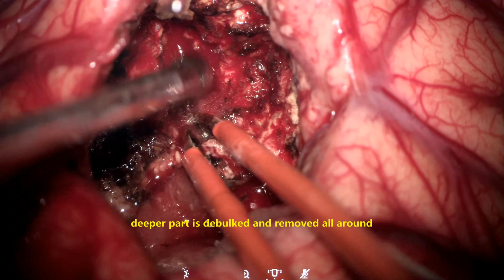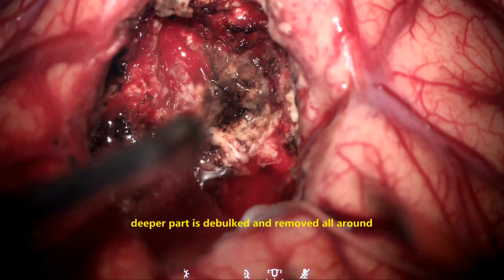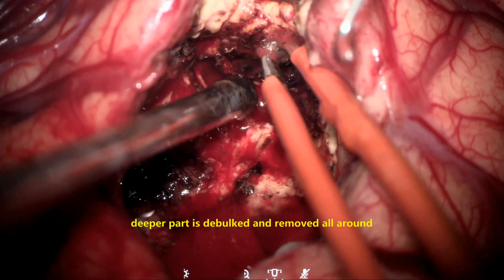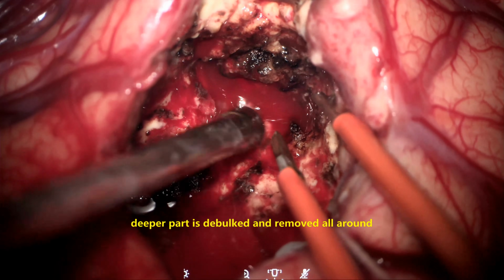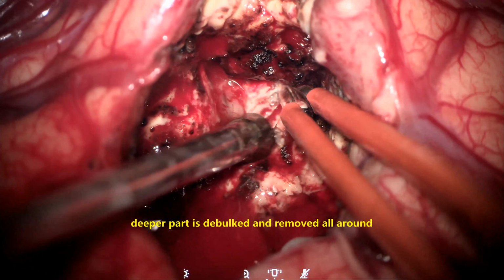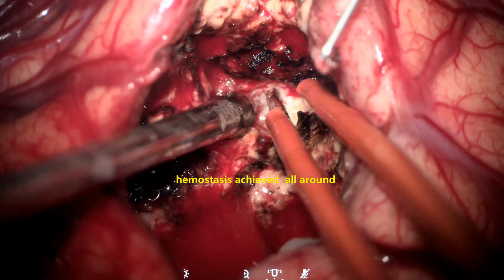Now there appears to be, again at the deeper parts, some amount of tumor. Again it is debulked and coagulated and hemostasis is achieved. Here it's very difficult to say that we have taken out 100% of the tumor, but what appears to us needs to be done. Here we can use fluorescein, angiofluorescein, or dye to confirm this, and you can have much more excision in these cases by using these fluorescein techniques.